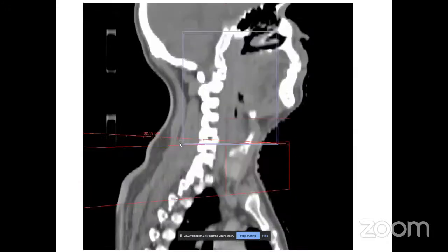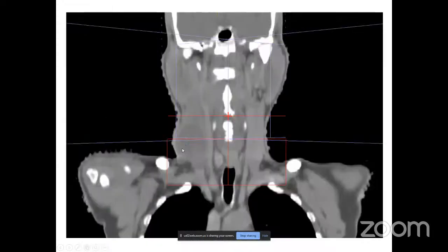But there are some problems with the bilateral and lower neck portals, because with the lower neck portal there is a divergence which can go into the bilateral portals. And as I mentioned, with the divergent beam in the bilateral portals, the high dose region can enter the lower neck portal.